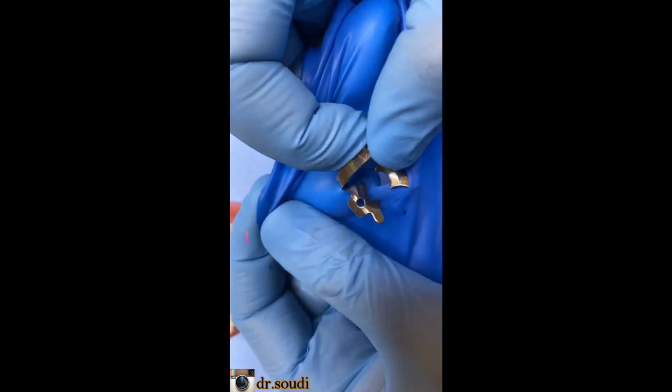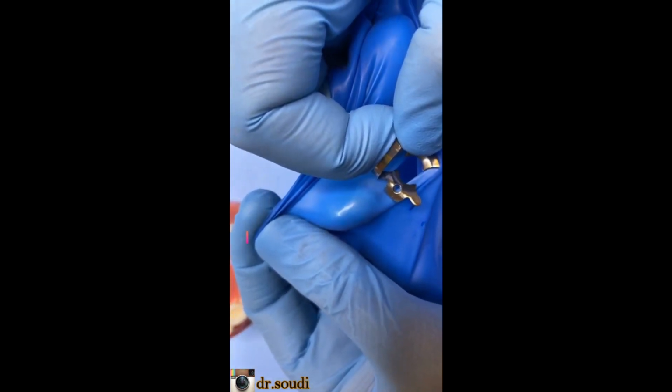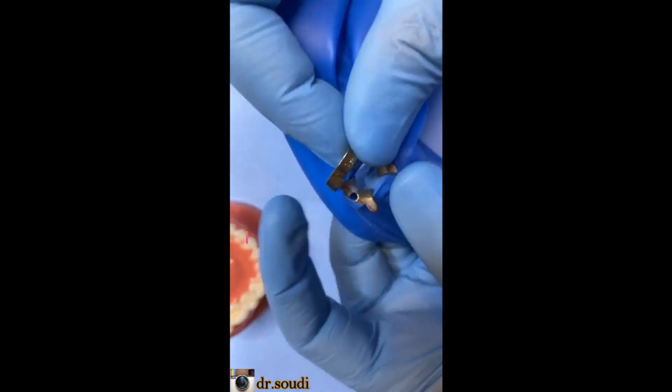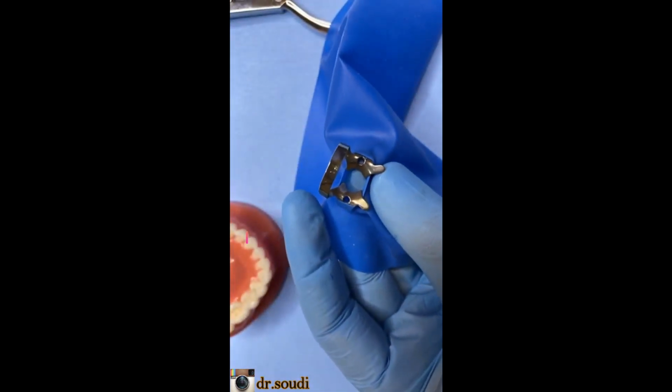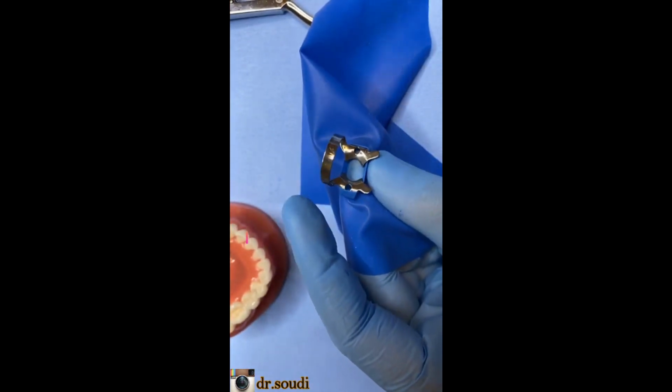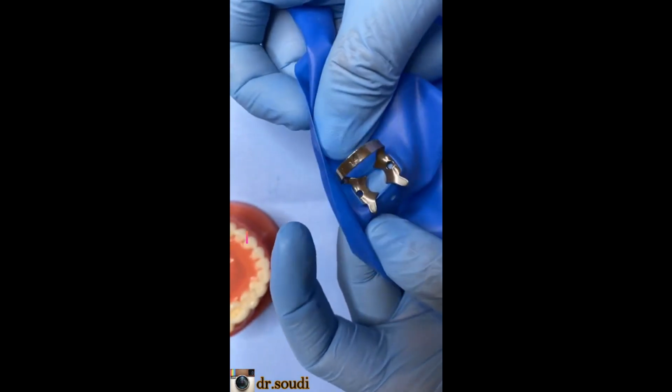For the wing like this, and stretch your sheet to the other wing. Now you can see it. The wing is covered with the sheet, the other wing is covered with the sheet. Okay, you can see it now clearly.